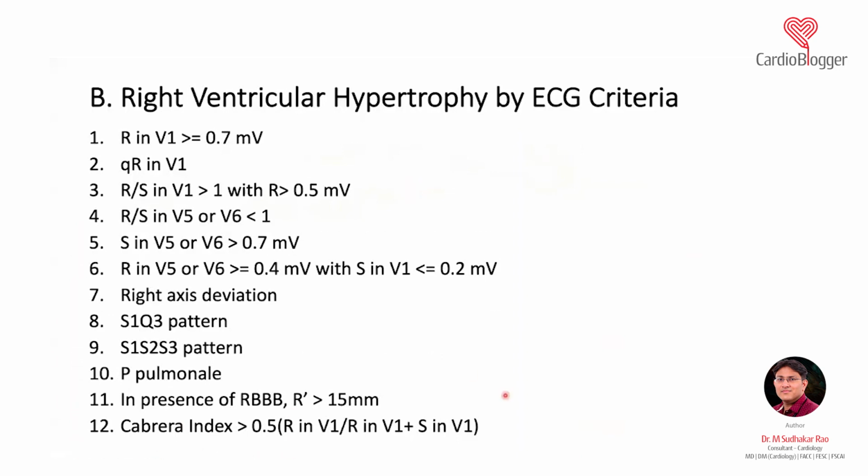Cabrera index is a very complicated thing. I won't take you into this, but just this name, if somebody asks you, it is usually shown to represent a right ventricular hypertrophy.